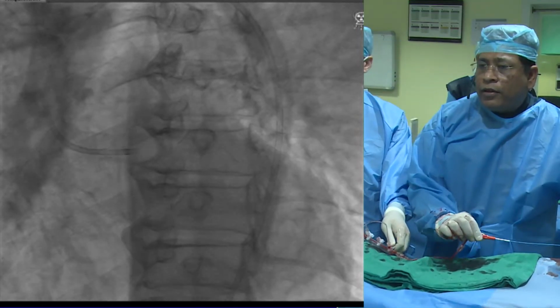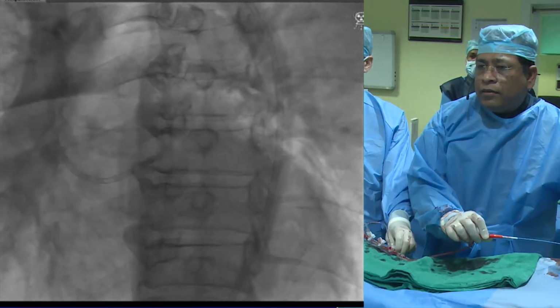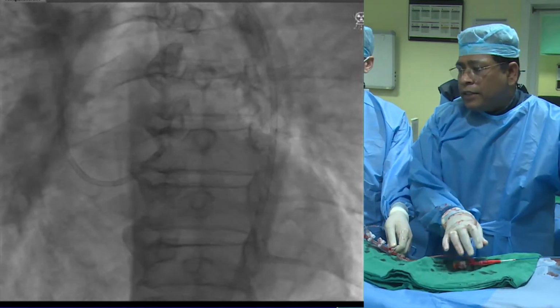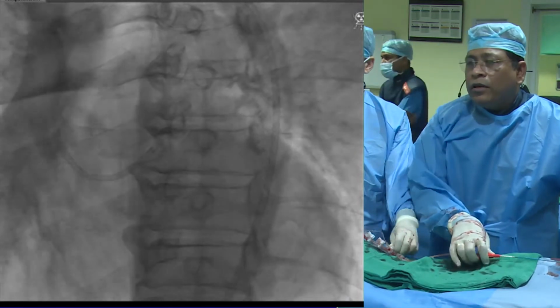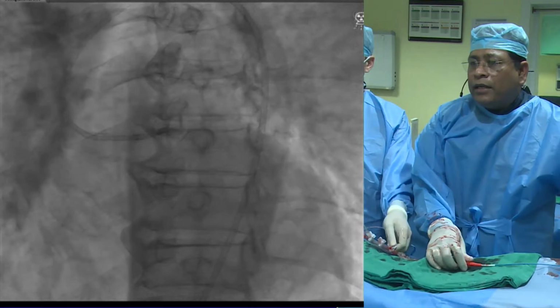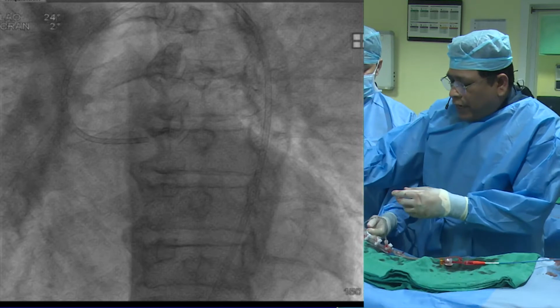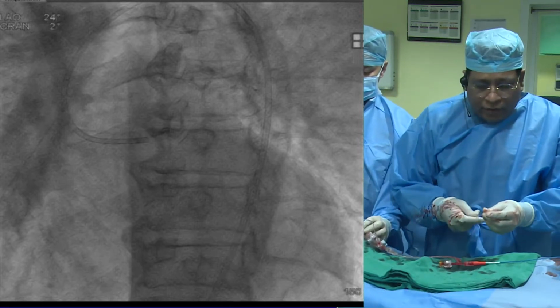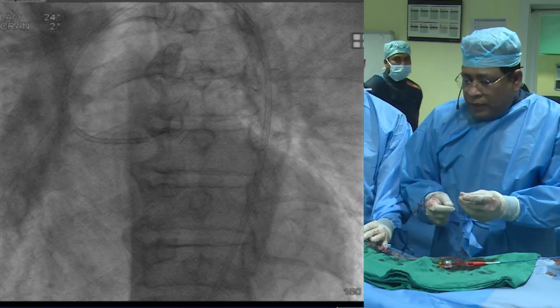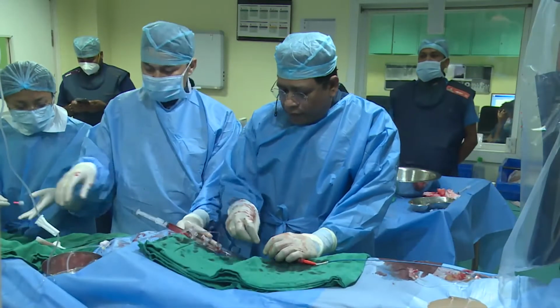Or sometimes we can directly take the guide wire, but that is a little risky, okay? So you can just give this saline. Okay, so you see the ST changes if it is happening? No. And it is more challenging when you are using a 7 French guide. No, I think we are there. So we can take a coronary wire then, okay. With a 7 French guiding catheter you can't play and take chances. So pulling, pushing. So better to go with a coronary wire if you are a little okay that it is somewhere near.